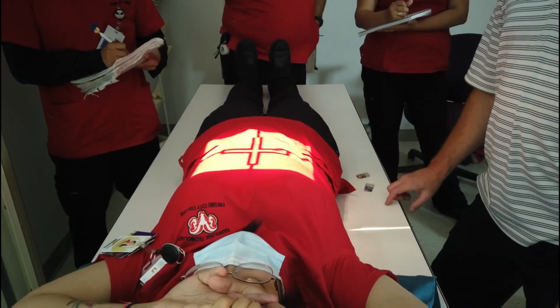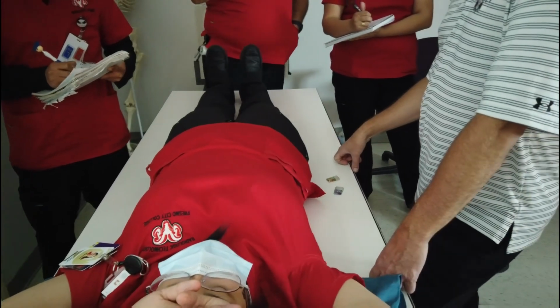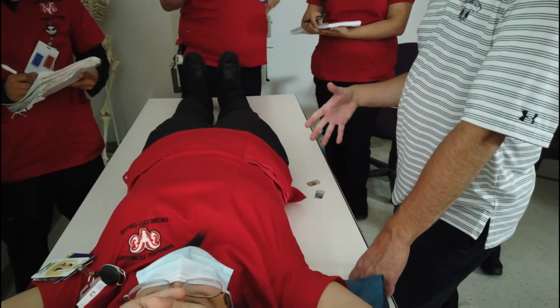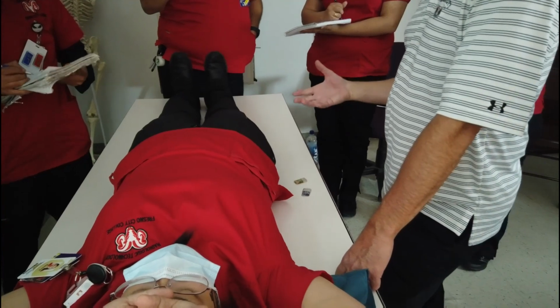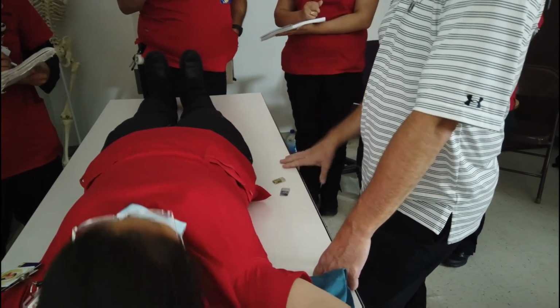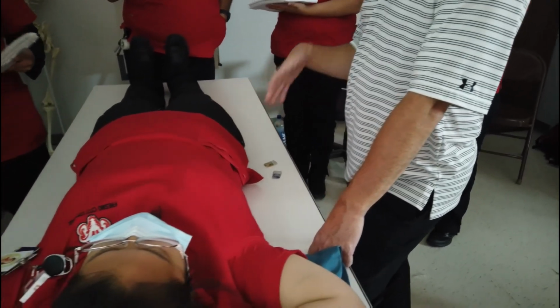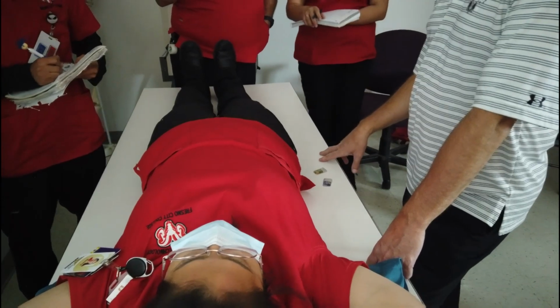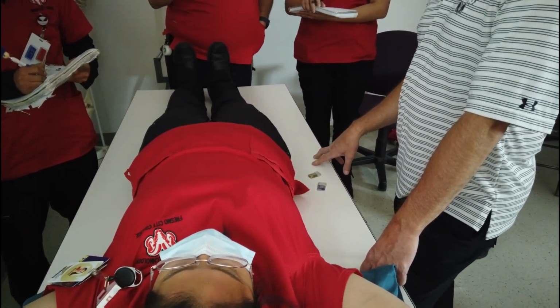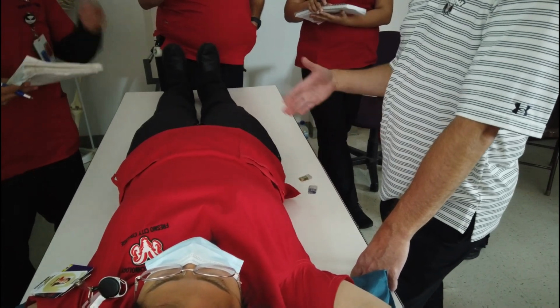This is the IVP exam. It might say kidney shots, or a scout of the kidneys, or a nephrogram. Nephros is kidney, right? So whatever it is, it's just the kidneys. I'm not going to show you a KUB or a scout KUB because you guys know how to do that. And I'm not going to show you the obliques because basically it's an oblique lumbar spine.